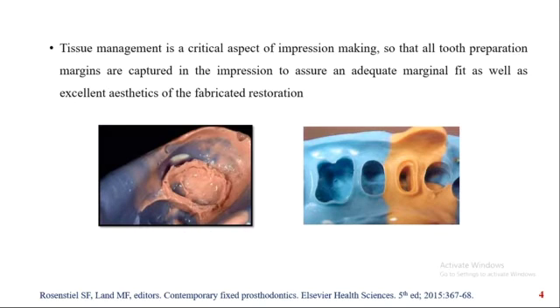Coming to tissue management, it is a critical aspect of impression making. It helps in recording the finish line. Also, it provides adequate bulk of the impression material between the prepared tooth and the gingival sulcus, which prevents the tearing and distortion of the impression while removal.